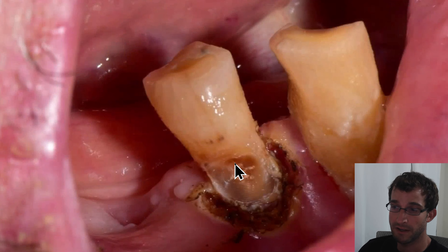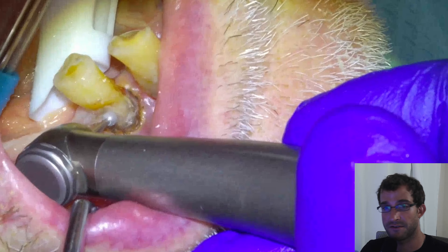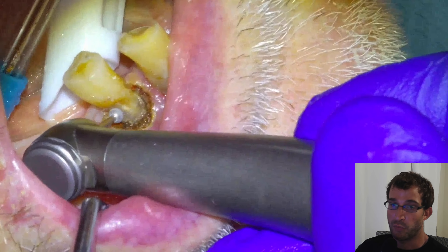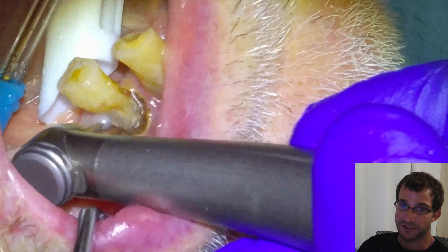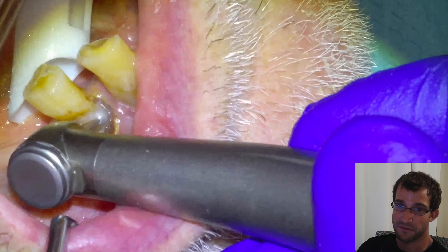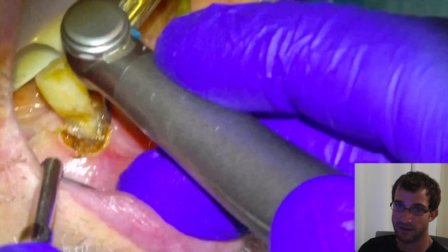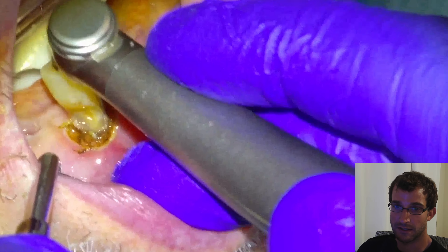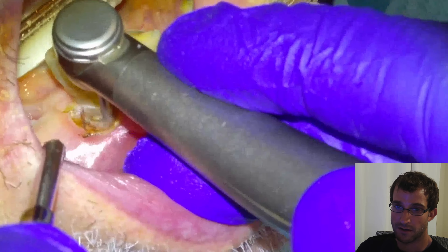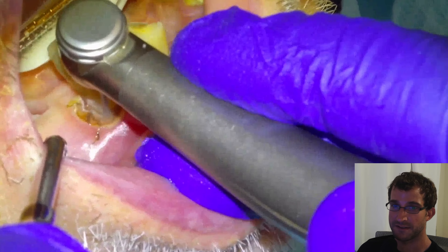This is a very calcified tooth — there was no lesion on an x-ray. This is an old patient; it's opposing a complete upper denture, so this is really just trying to give the tooth some life to get this patient to the finish line. Once we have removed the tooth decay, sometimes we'll just go in.